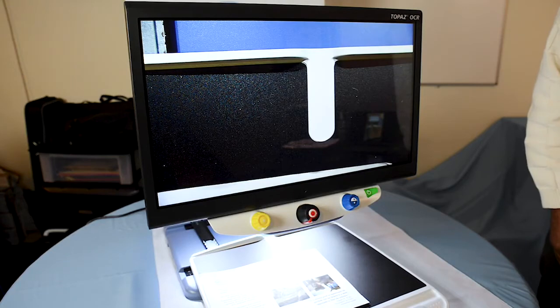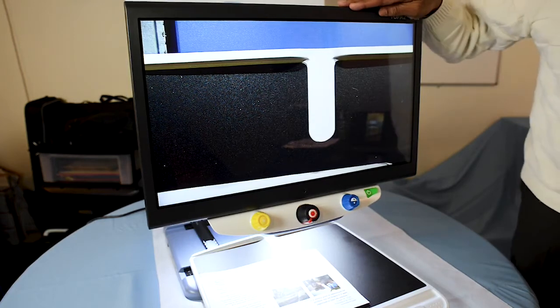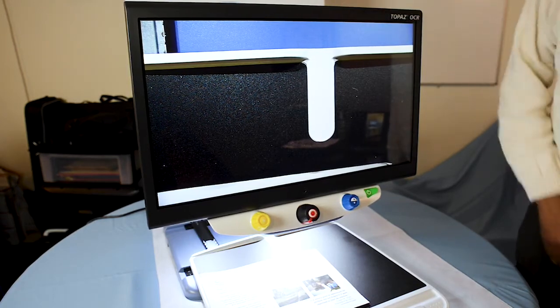To round out the Topaz OCR — it is a really stable and sturdy CCTV or desktop magnifier.